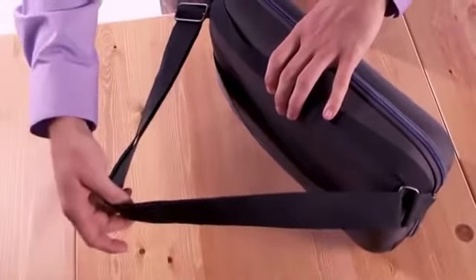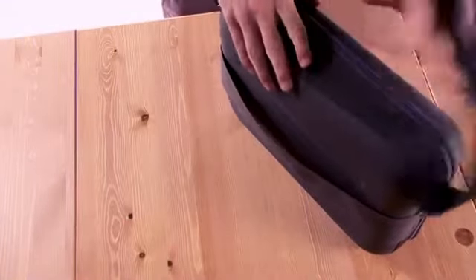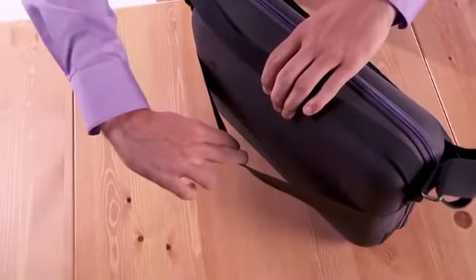For ease of use, it features an adjustable and removable shoulder strap as well as a sturdy trolley strap to hold it onto your suitcase.